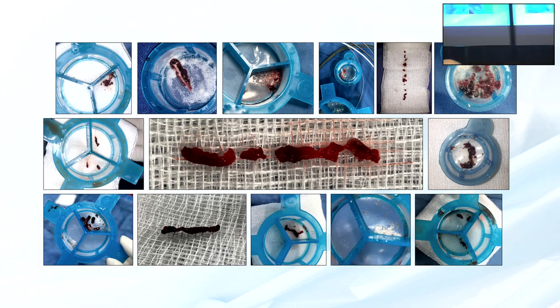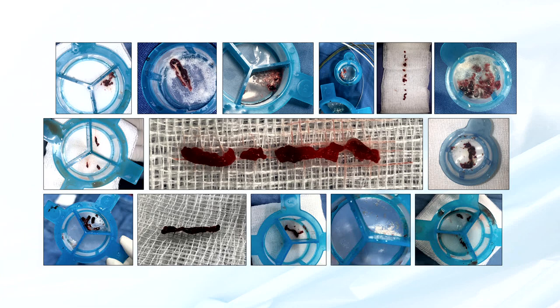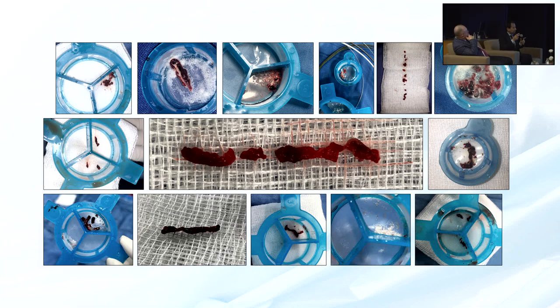They're beautiful suction results. But one other option is localized lytic therapy. If you put a balloon distal to the occlusion, you guide extension catheter wedged into the lesion, and then 10 milligrams of TPA left to dwell for 10 minutes. Then the guide extension can go forward and suck out what is in between. It can be highly effective at eliminating thrombus. We've done 5 cases like that.